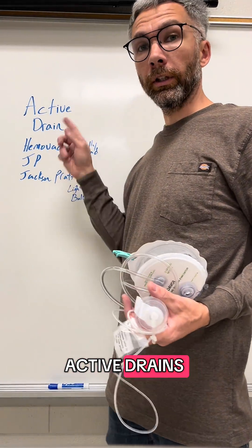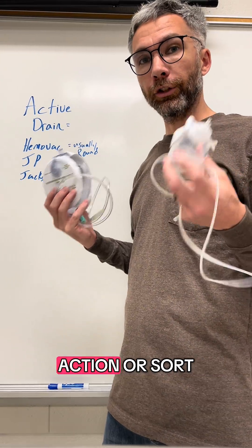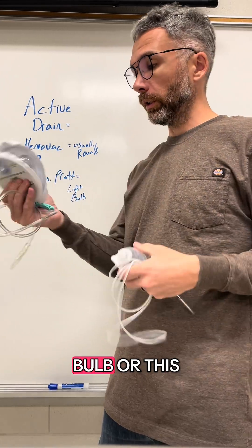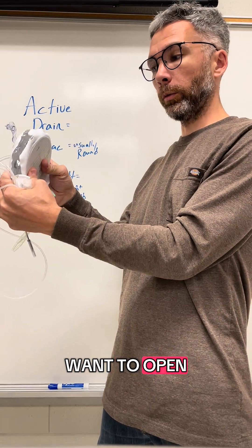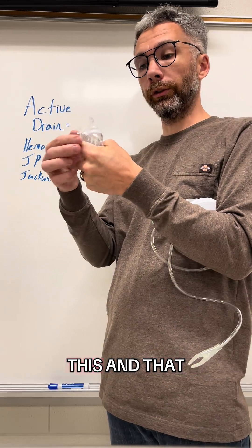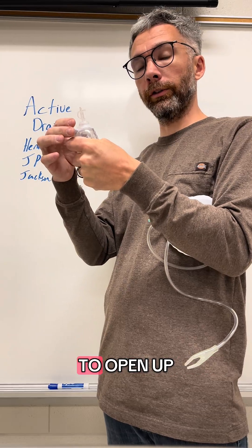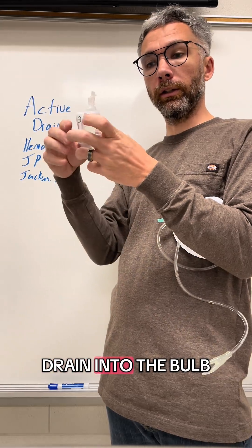Let's go over active drains: Hemovac, JP, Jackson-Pratt — these are active because they have some sort of suction action, whether it's a bulb or a disc with springs that want to open up to create suction. Typically your JPs are going to have these bulbs. When you close the bulb and the wound is airtight, the bulb wants to open up and starts drawing fluid from the wound through the drain into the bulb.